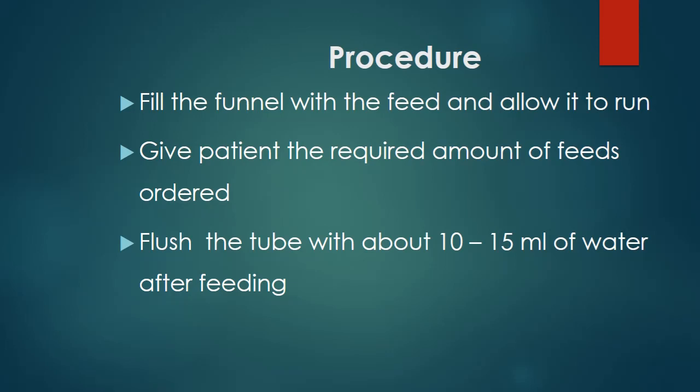However, it comes with its own disadvantages, because normally, when we are eating, the food flows through the body by gravity and peristalsis. But in the case of the bolus feeding, you would see that the pressure you are using to push the food is going to force the food to flow under a higher pressure into the patient's stomach.